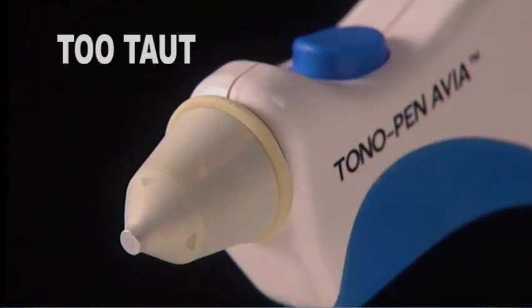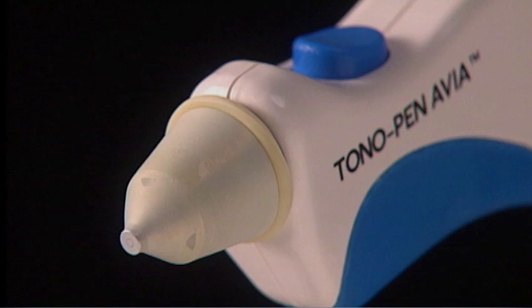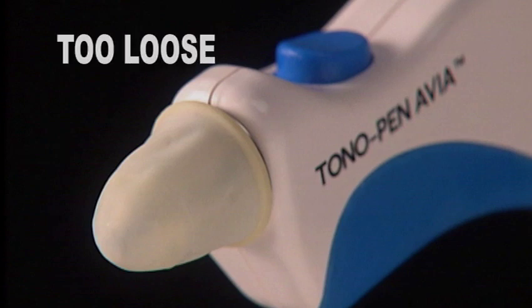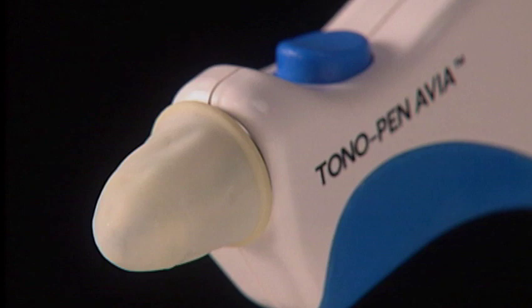If too taut, the Occufilm Tip Cover might introduce resistance in the micro-movement of the transducer post, which could cause readings that are too high. On the other hand, tip covers should not be too loose so that they form a fold or a crease over the transducer. Adjust the tension until pleats are evident.